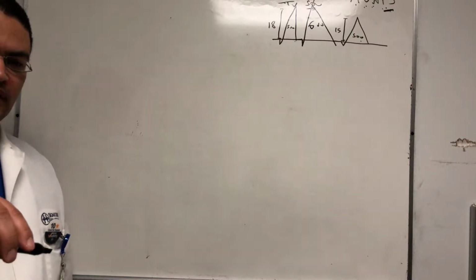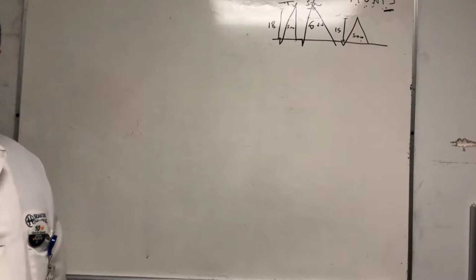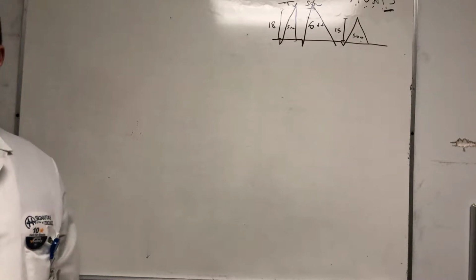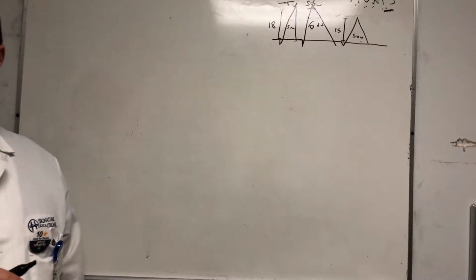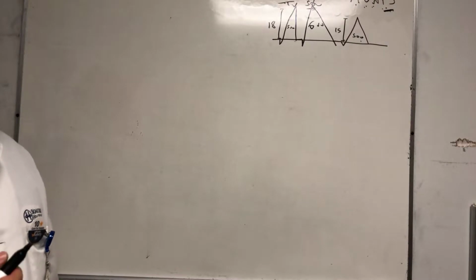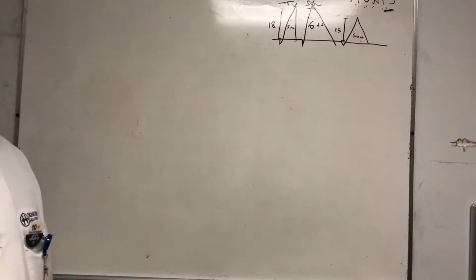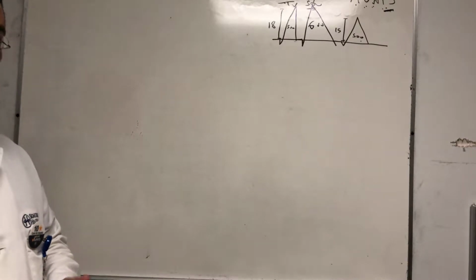We are trying, beginning from this month, to use AVAPS on every BiPAP patient on the second day, right? Let's try to remember that. I don't want to make it more automatic, but I think we're going to have to remember to actually do the AVAPS as a second mode of BiPAP on every patient.